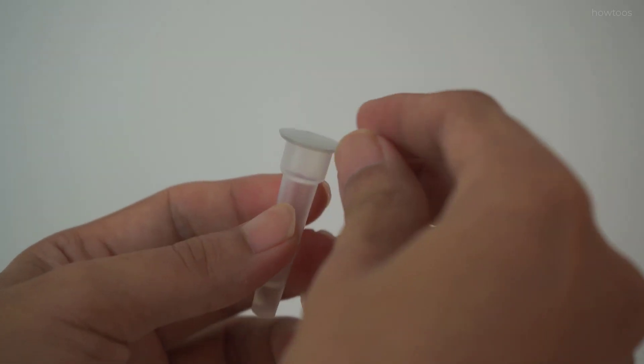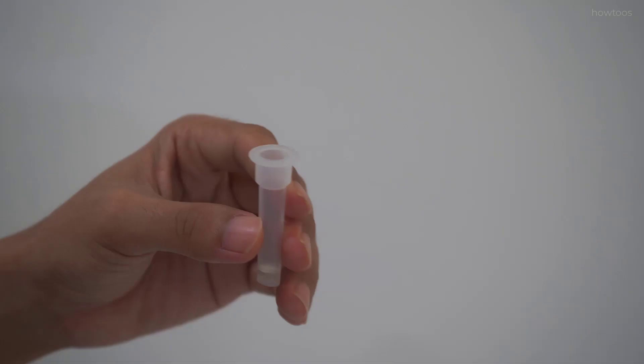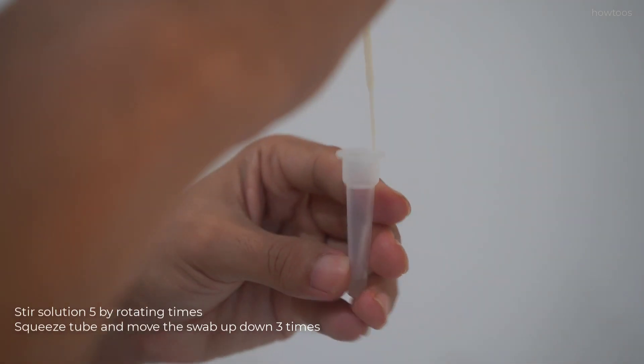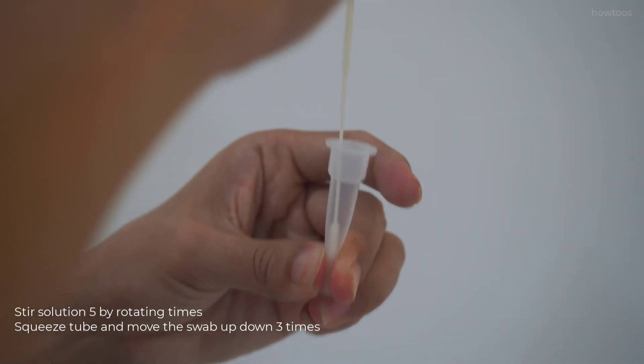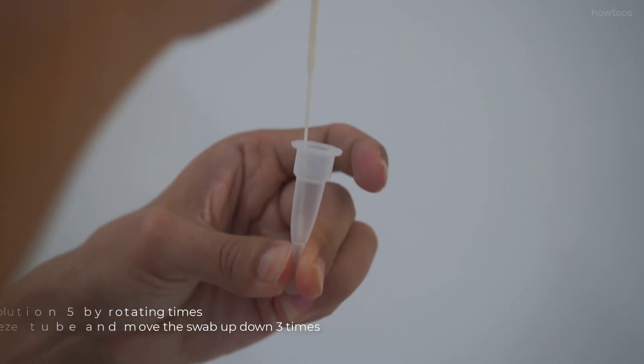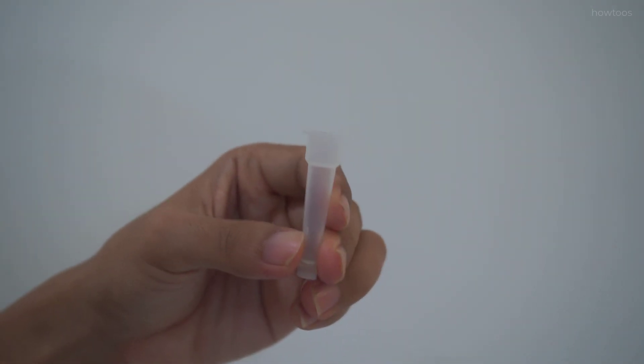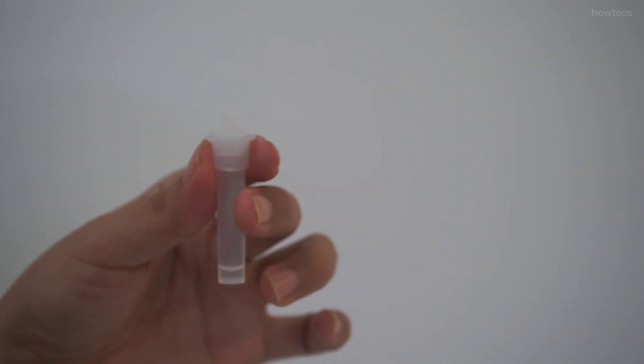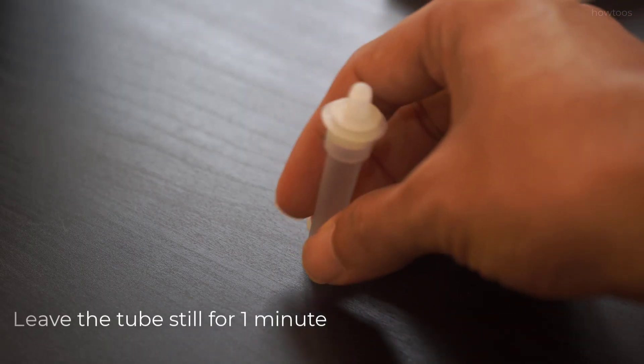Peel off the foil from sample extraction tube. Place the swab into the tube. Use the swab to stir in the solution at least five times. Move up and down for at least three times to expel any sample solution from the swab. Insert the tube cap firmly on the sample extraction tube. Put the tube still for one minute to release viral antigens.